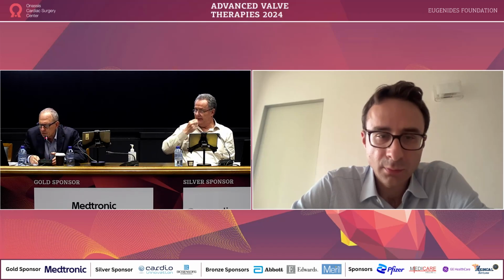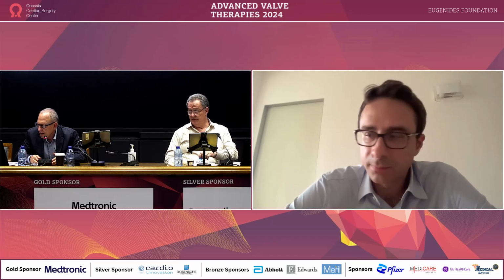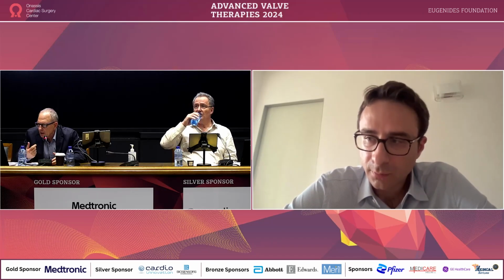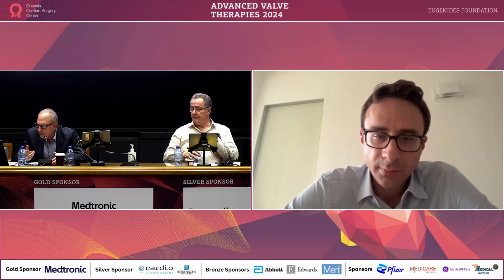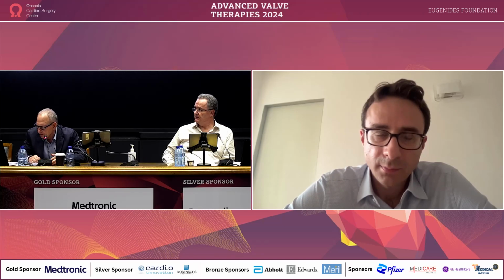Just a very quick question, because in the field there are a lot of devices coming out. For example, we had this CSI, we saw an Omega device. Do you think these devices, by changing the behavior of the occluder, might facilitate the procedure, the position and all this stuff, so they're kind of self-aligning, regardless of the angulation? What's your opinion?